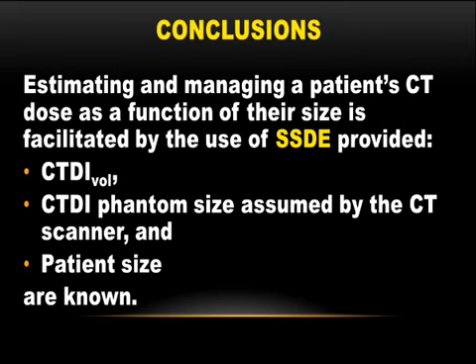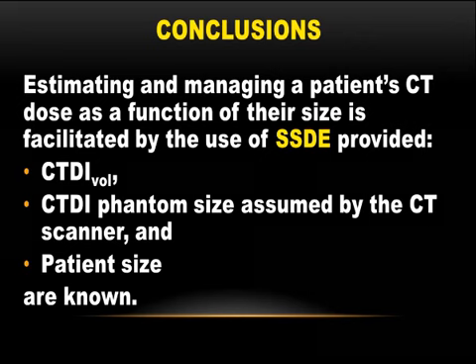I know Radiometrics is calculating SSDE, but I do not know what they're doing to compensate for that. Do you know? No, they have not told us what the accuracy is of that, but I'm pretty sure that they run into the same issue that the SSDE runs into, which is if you have a combined body part like chest and abdomen, it's going to average out and underestimate or overestimate for some regions.